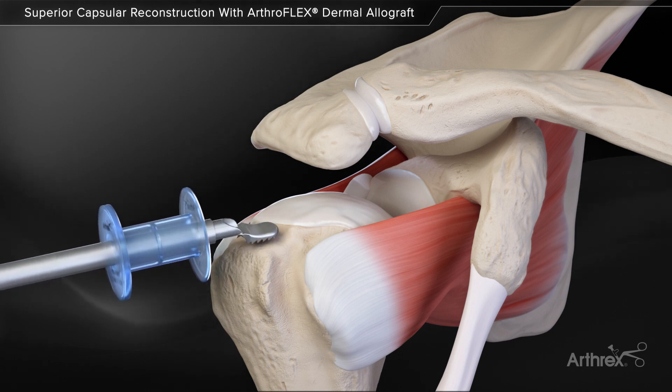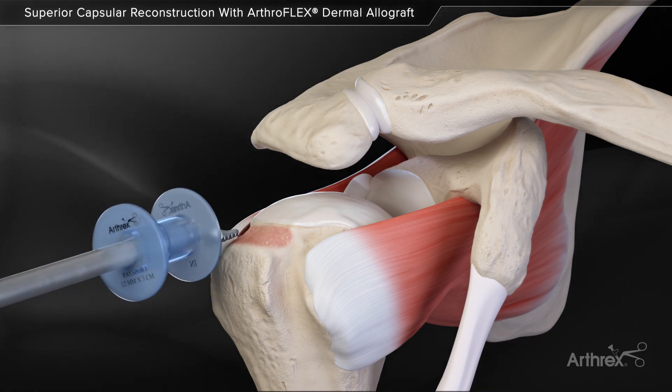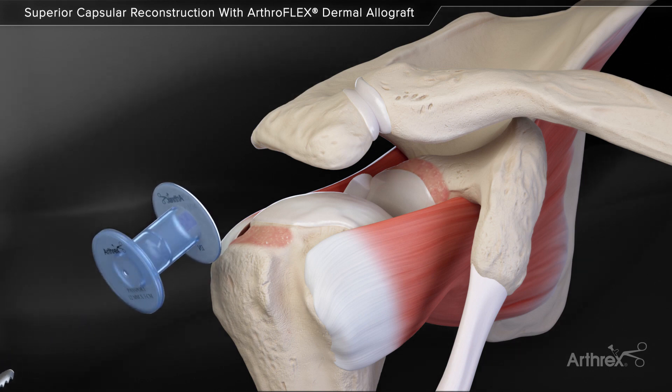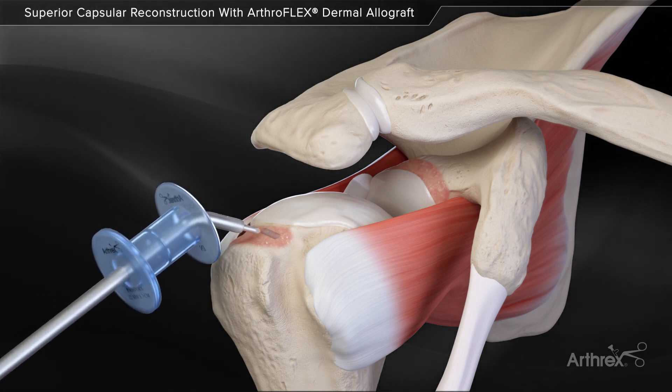The superior glenoid and humeral tuberosity bone beds are prepared using a flush-cut burr and power rasp. The power pick is used for additional footprint preparation to maximize vascular channels.